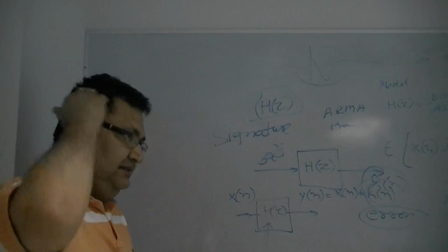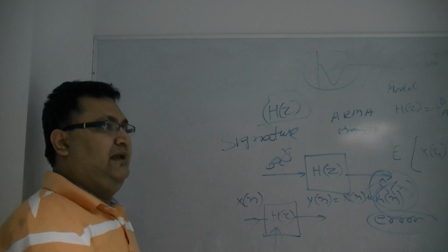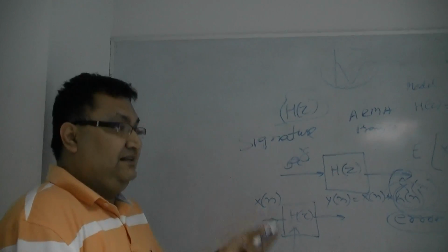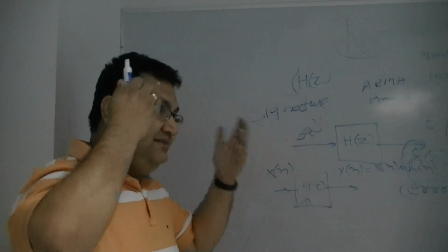My target is to create signatures of different brain functions. Brain function can be anything like eye movement, hand movement, leg movement. The signal starts from here. Suppose I have to do any body movement. I'm thinking that I'm moving my hand, but I didn't move. Another thing, I'm thinking that I'm moving my hand and I'm moving too. So what should be the difference in brain signal?